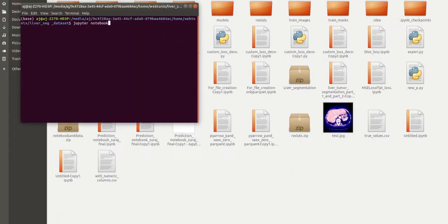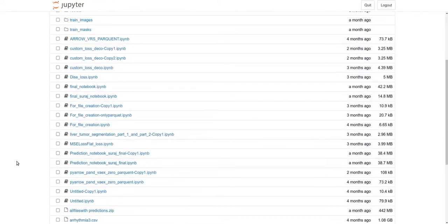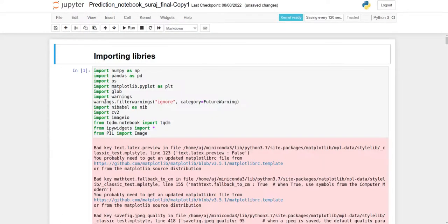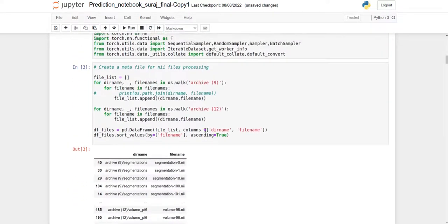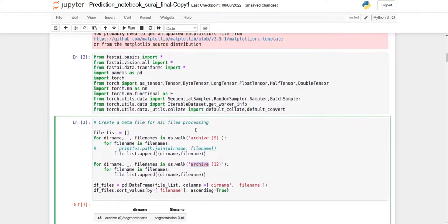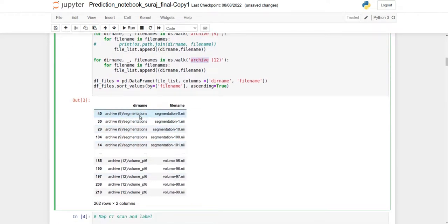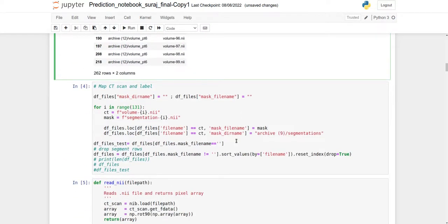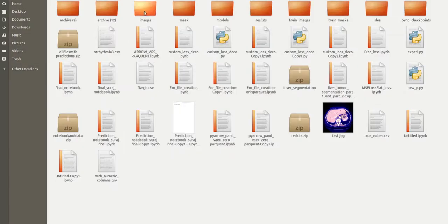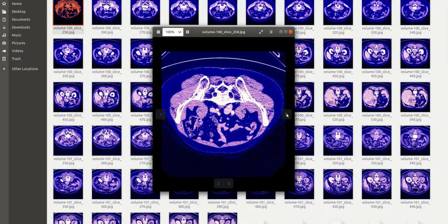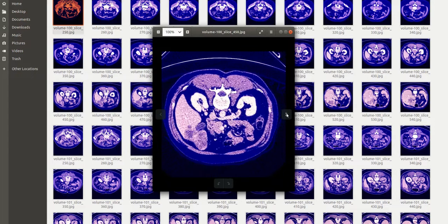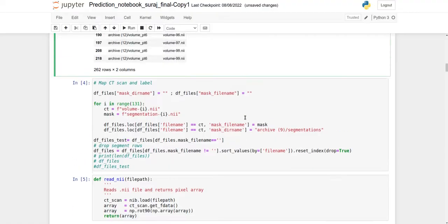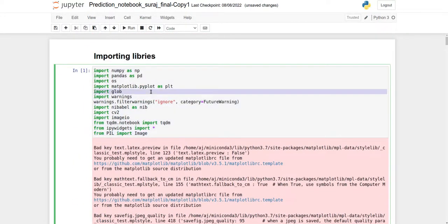FastAI really simplifies medical segmentation. You can see my images are in Archive 9 and Archive 12 folders. First, we walk through every folder to get the list of files and directory names, then map each image file with its corresponding segmentation file. We then create two-dimensional images from those 3D images.